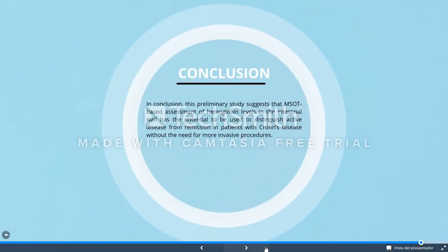In conclusion, this preliminary study suggests that MSOT-based assessment of hemoglobin levels in the intestinal wall has the potential to be used to distinguish active disease from remission in patients with Crohn's disease without the need for more invasive procedures.